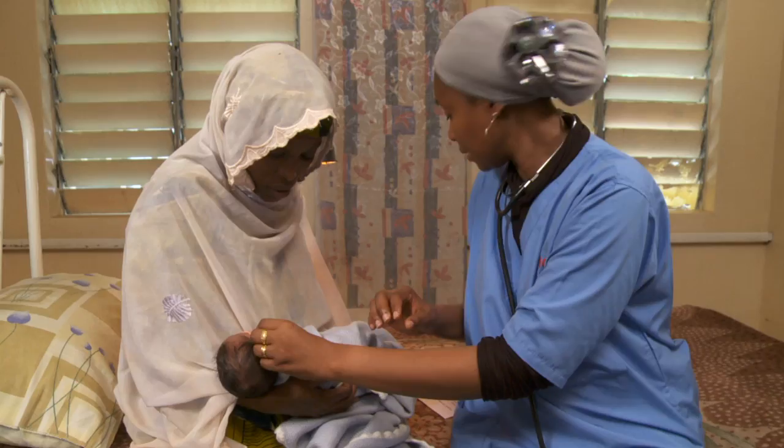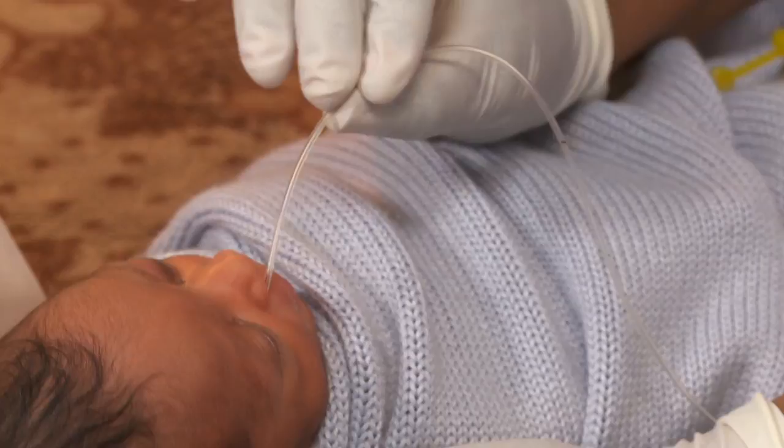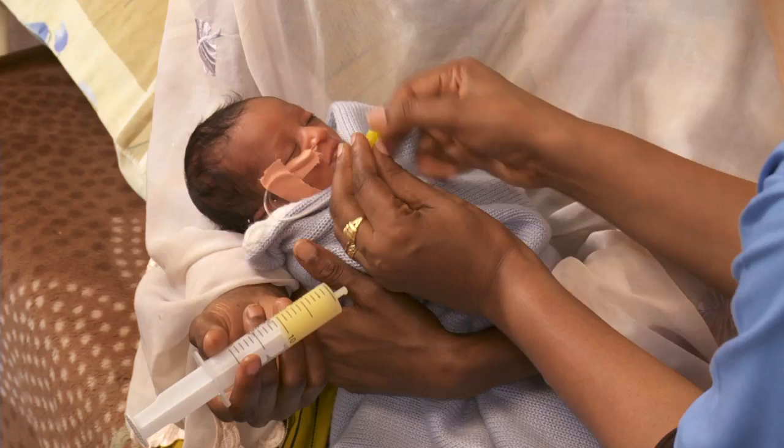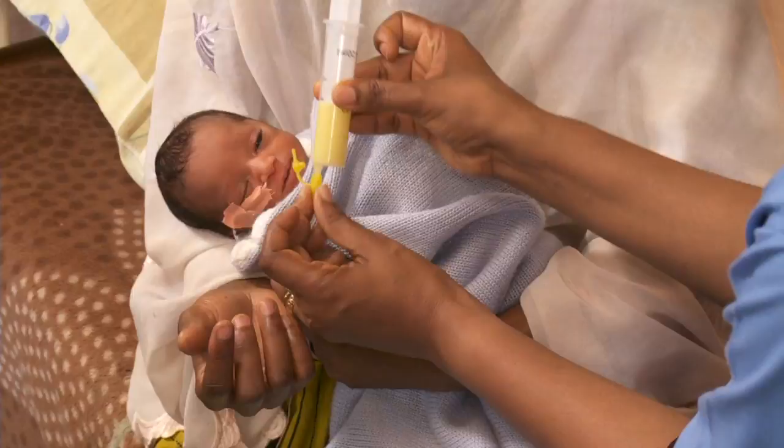If the mark has moved, adjust it or replace the tube and recheck the placement. Then connect the syringe, remove the plunger, and hold the barrel just above the baby. If the milk is not going in, barely insert the plunger and push down slightly, then remove — the milk will move slowly into the baby's stomach.